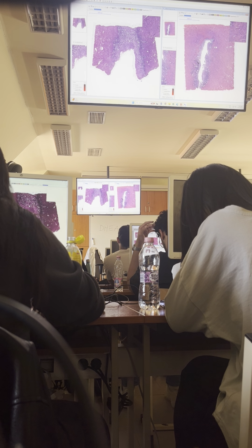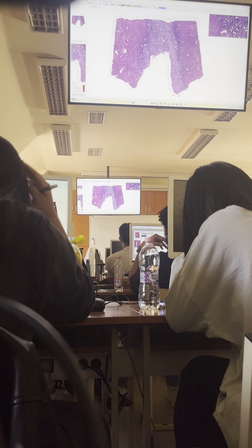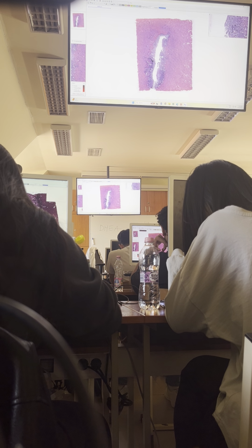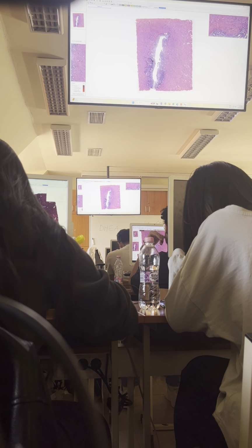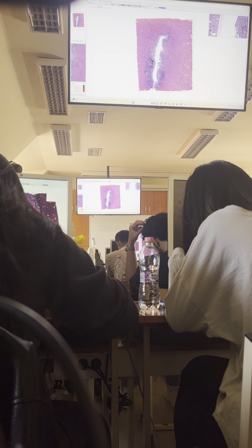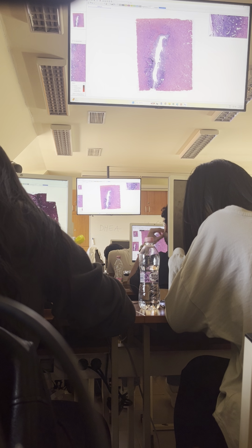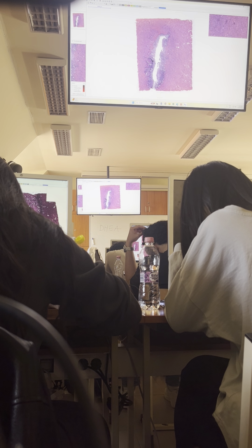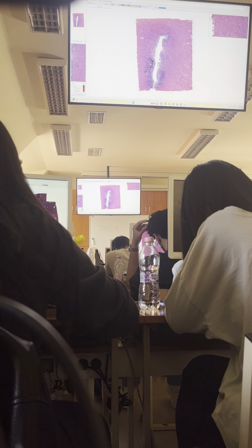So let's start with the estrogen phase or proliferative phase. No, this is not the one. The other one. So this more bluish territory here, this is the endometrium. This is the cavity of the uterus, of course. Endometrium, the mucosa of the uterus. Now, altogether, the rest is really something. This is the muscle layer of the wall.